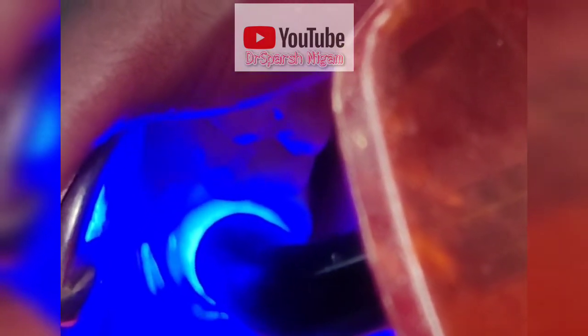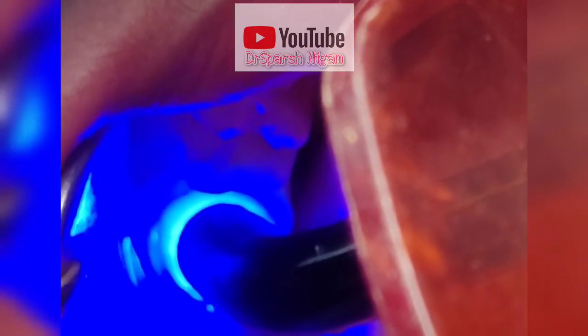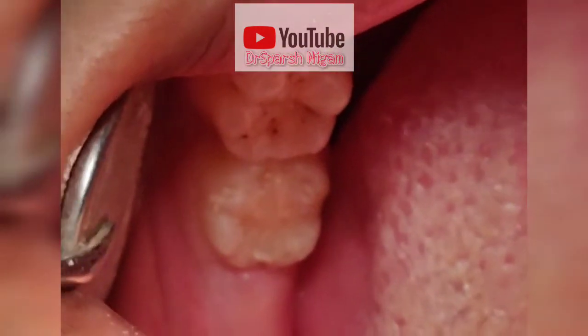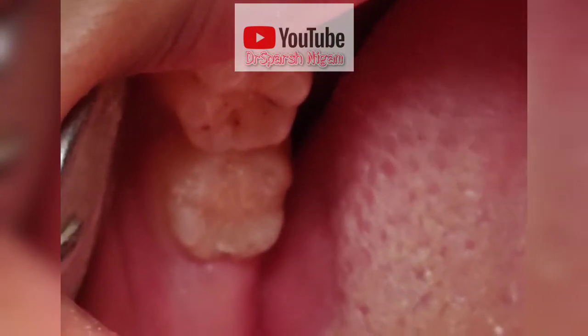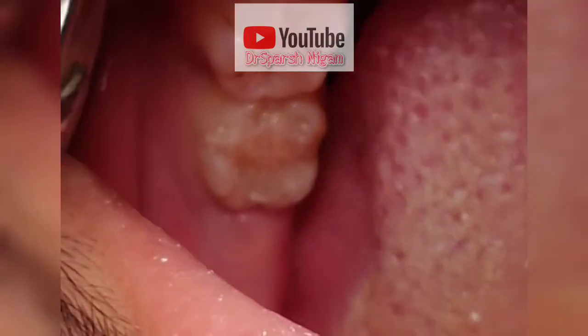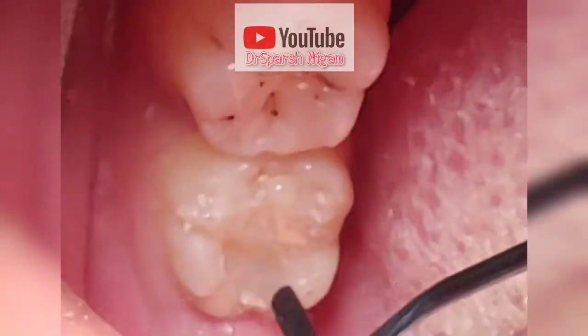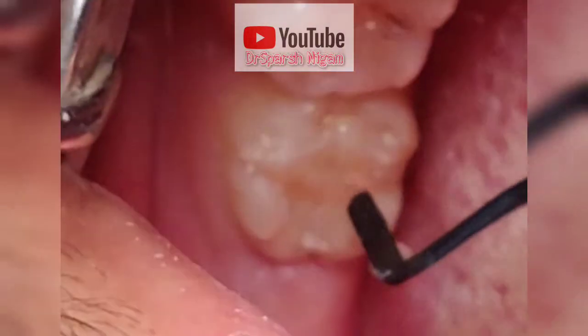For the filling to get completely cured and then it gets hardened. It is a composite resin filling — it is light activated. Now we will check if the filling is hardened or not. As you can see, the filling has been hardened and it has taken a very beautiful color of the tooth also.